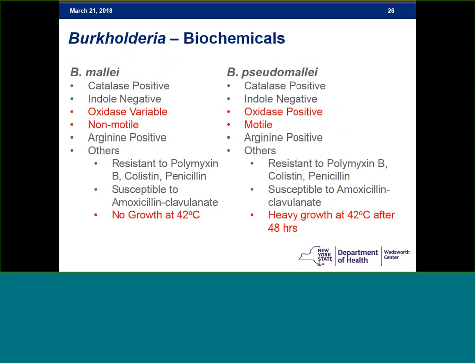Biochemically, unlike other Burkholderia, both B. mallei and pseudomallei are arginine positive. Additionally, B. mallei and pseudomallei are catalase positive and indole negative. B. mallei will be non-motile and oxidase variable, while B. pseudomallei will be motile and oxidase positive.